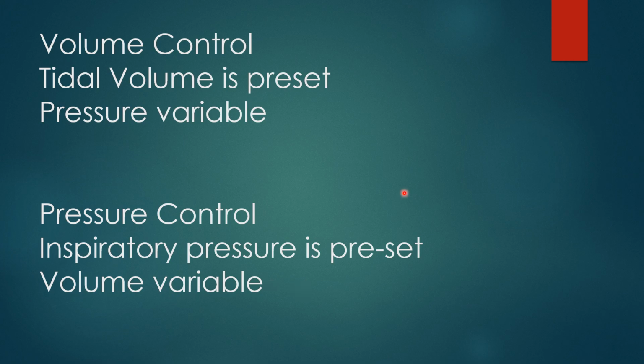Now, you'll have some respiratory therapists and doctors tell you, well, I prefer pressure control. And others say, well, I prefer volume control. Which one is better? Well, if you got the same tidal volume and the same respiratory rate, the blood gases in the patient will be no different. And they have not really found through studies any difference in these two ways of ventilating the patient, either targeting the pressure or targeting the volume.